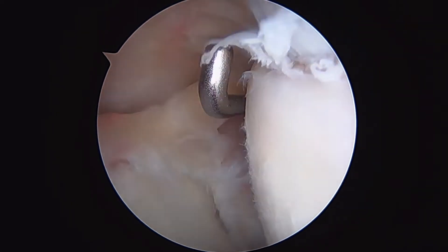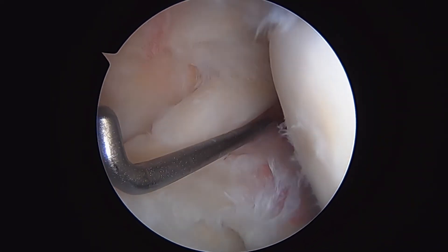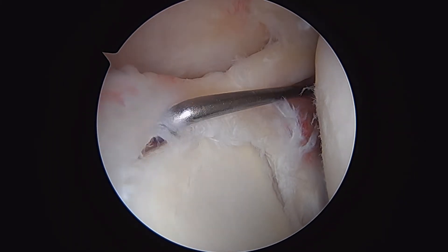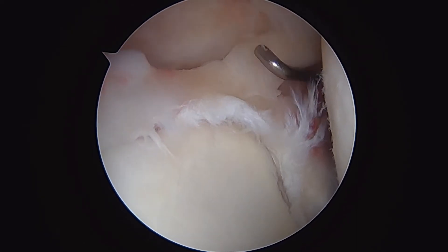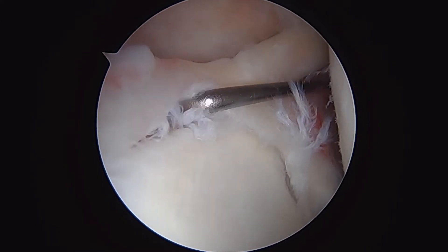I've got my probe in here through the rotator interval. Above us is the long-headed biceps tendon. And here is her problem — this is a superior labral tear, which you can see pretty clearly here, involving this bicipital labral anchor complex along the superior glenoid rim.